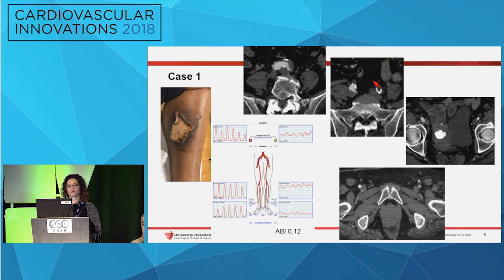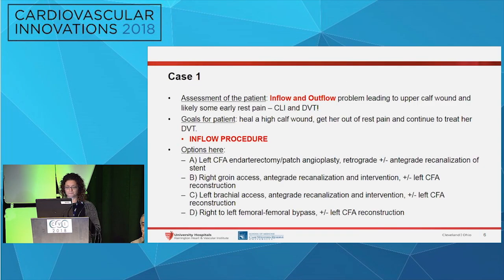What wasn't very clear in the story was that she had had a previous left common iliac stent, which was obviously occluded. This went down to the level of the hypogastric artery, and she reconstituted to a very distal external iliac artery just above the circumflex vessels, and what could be interpreted as some common femoral artery disease versus an underperfused vessel.